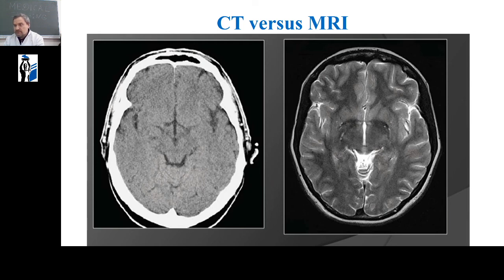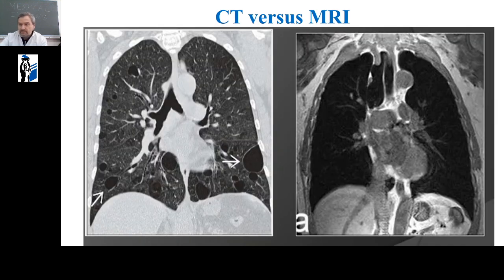The task of a detailed analysis of the structure of lung tissue to identify multiple foci of destruction of the pulmonary parenchyma, evaluation of the pulmonary pattern, evaluation of the smallest structures in a thin layer of lung tissue is carried out using computed tomography.